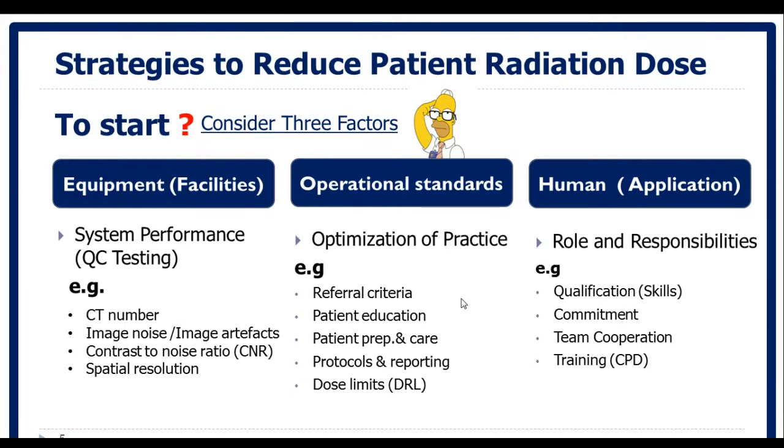For the application, the human factor, which is very, very important, we need first of all to specify who is responsible to minimize the patient radiation dose.